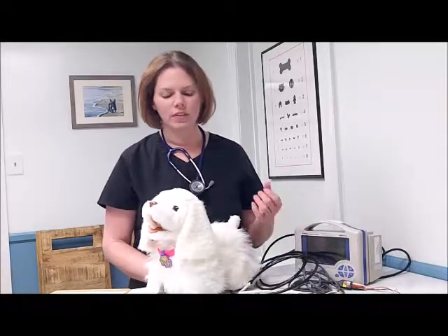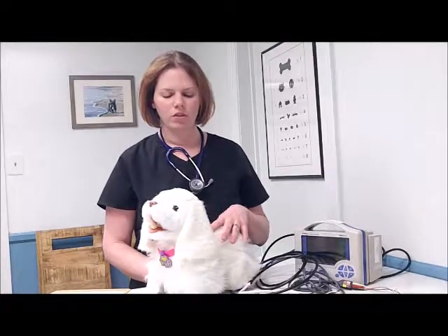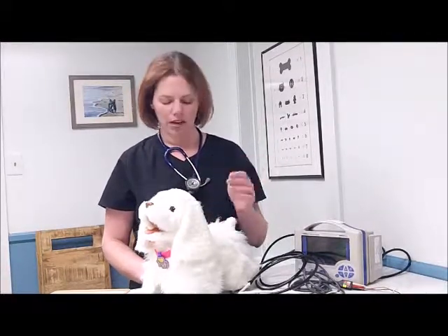Our patient is not breathing on its own regularly, so we need to bag him more often. There's definitely all sorts of things that you as the anesthetic technician can address, catch, correct, and bring to the attention of the appropriate personnel to fix, to make sure that your patient has a nice, smooth transition from induction to procedure and a nice, smooth recovery, and that our entire anesthetic protocol goes the way it is supposed to.